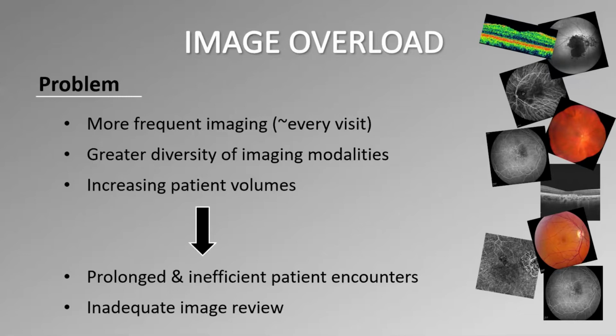Number one, either we engage in these prolonged and inefficient patient encounters in which we spend a large amount of time reviewing images, clicking between different softwares, and typically having our backs to the patient. This is obviously not an efficient way to run a clinical practice. The second alternative is that we engage instead in inadequate image review, in which providers fail to maximize the diagnostic value of the imaging that they've obtained. I think they both lead to poorer quality clinical care.